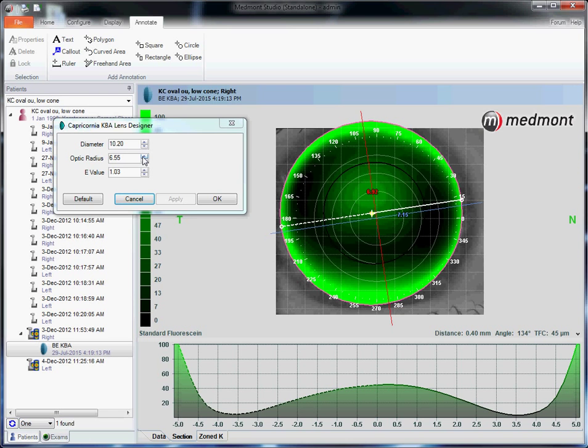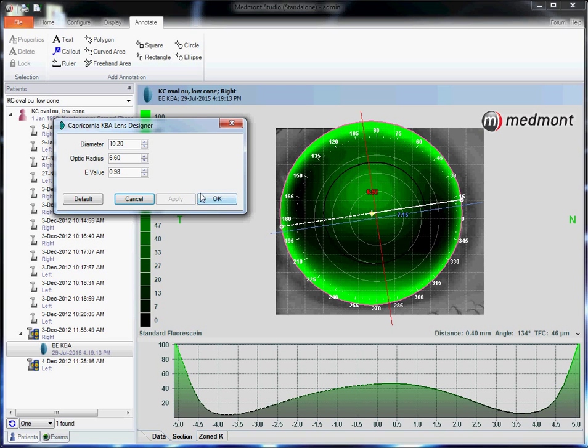Next, choose parameters that are in your diagnostic set for this particular specialty lens. Then click your cursor in the center. Measure the apical clearance. We're at 46 microns. In a normal eye, we ideally want 20 microns of fluid at the apex. In a diseased eye, a little bit more, maybe 30 microns, in order to protect the cone, in order to be sure that we're clearing the diseased area of the eye.